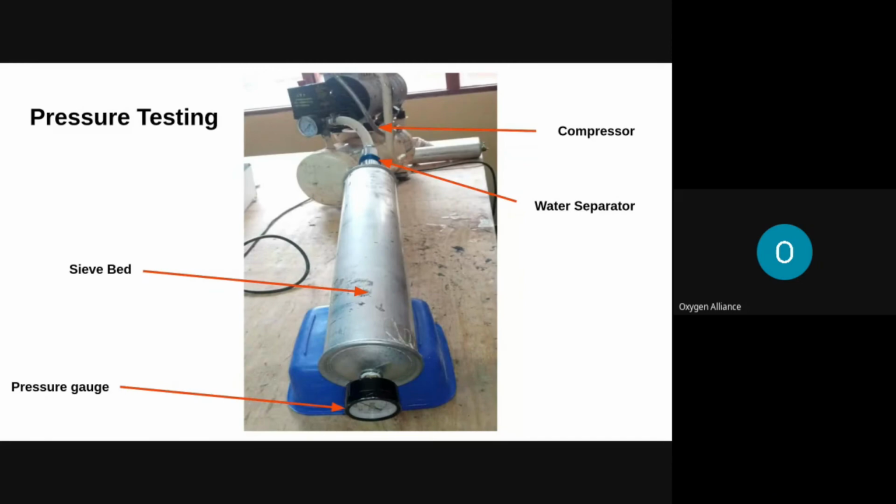If you just open the sieve bed of an AirSep, put in zeolite and just close it, it's going to leak most of the time. Why? Because the seal is gone. So an alternative is using the head of the roofing nails. It has some rubber seal, so you can just put it in there. It works, and then you put in the nut. Or another way, you could just find the right washer.